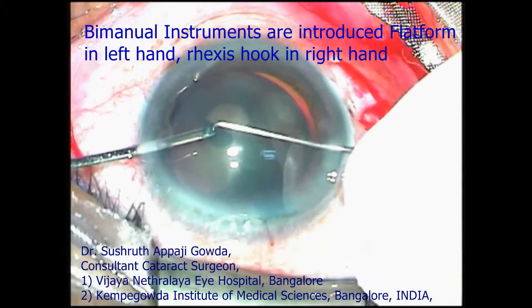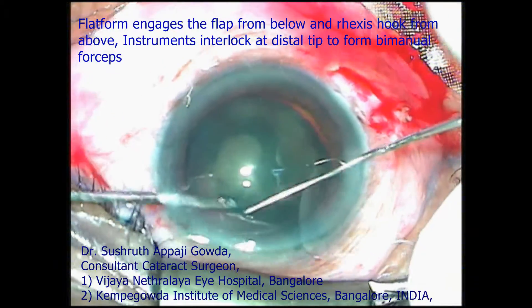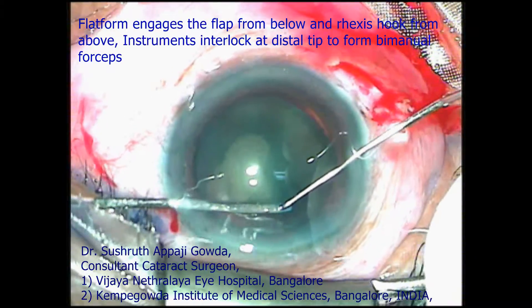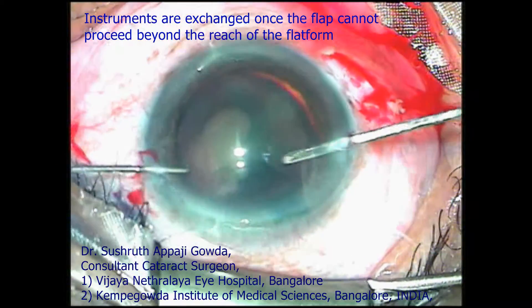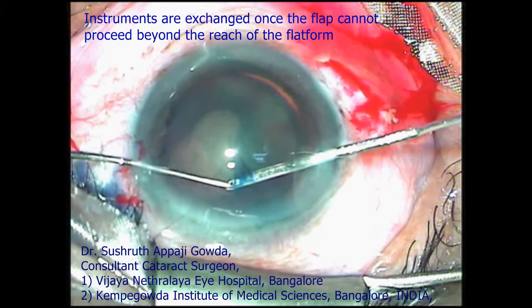The platform, with a groove on its distal tip, always engages the flap from below and acts like a platform. The rhexis hook is a shortened Sinsky hook whose distal tip fits into the groove over the platform. The flap is engaged near the shearing margin and pulled for desired shearing.